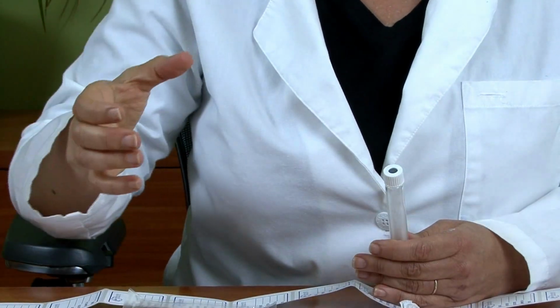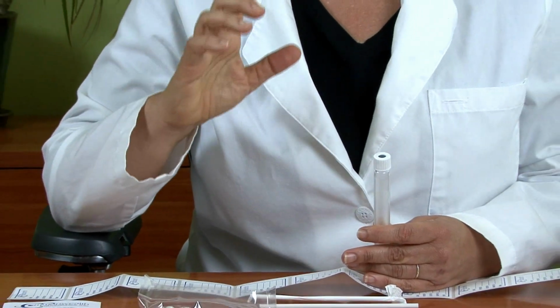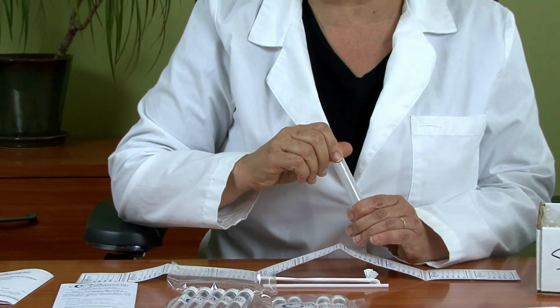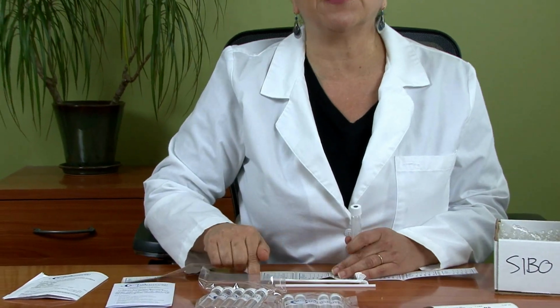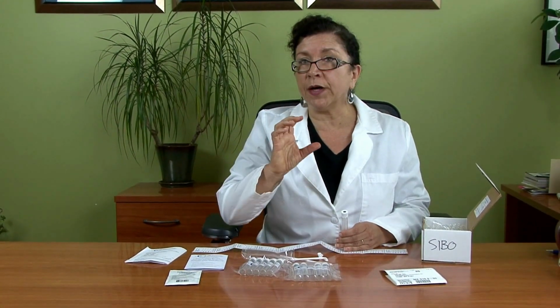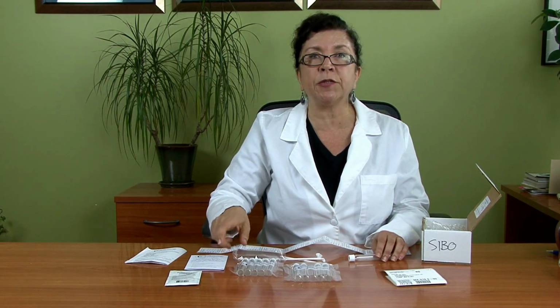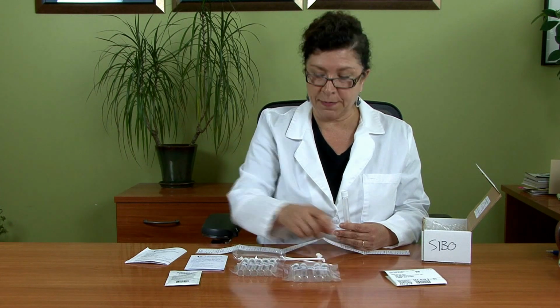Now pick up your glass with your Lactulose in it and completely drink the Lactulose solution down. Start your timer, because now you're going to start collecting your specimens every 20 minutes. So if you start this at 8 o'clock in the morning, you collect the specimen and you drink your Lactulose down. At 8:20, you're going to go to tube number 2, and you're going to repeat that at least 9 more times. Tube 2 through tube 10.